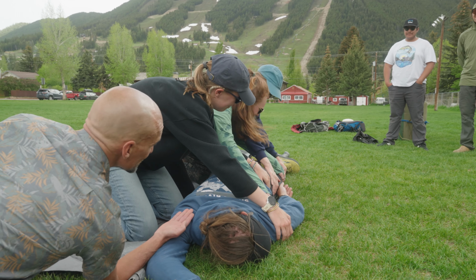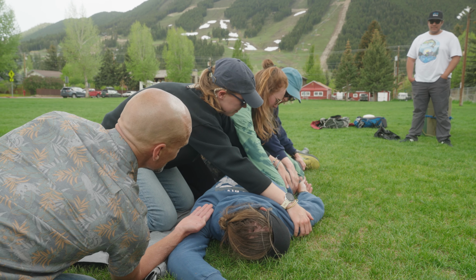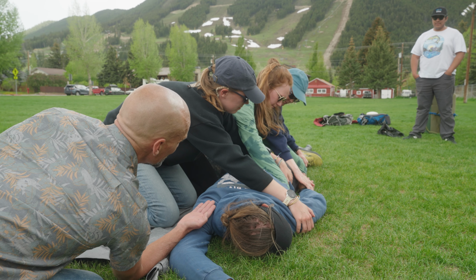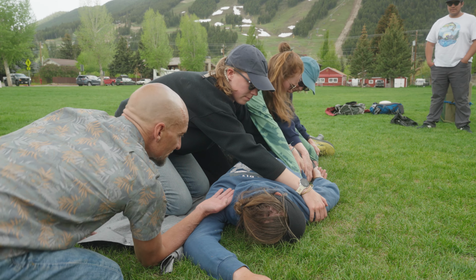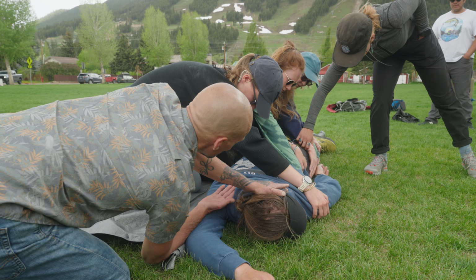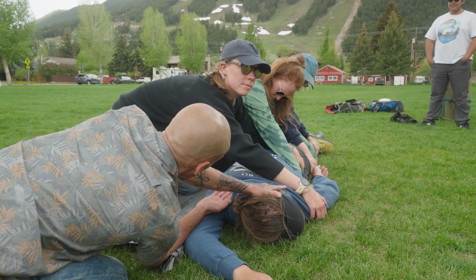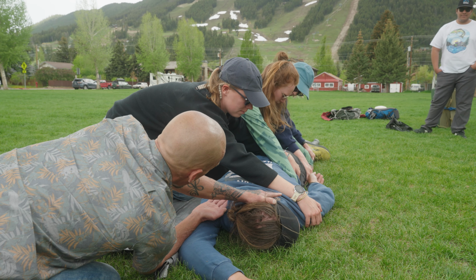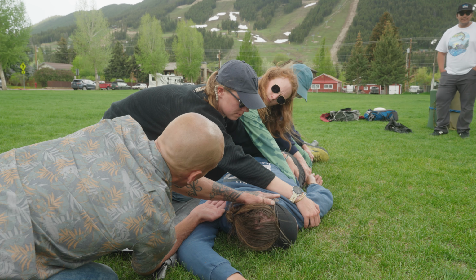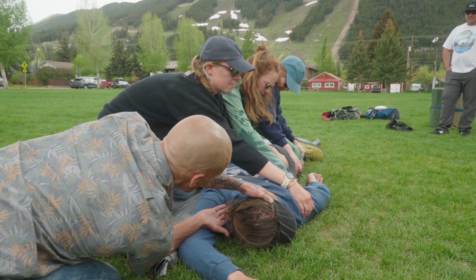Hands in position, so lead position, shoulder, hips, hips, knees, and then knee, ankle, crossing at the junction with your partner. On the count of 3, we're gonna slowly roll the patient towards you, onto their back into a supine position. Is anyone not ready? On 3. 1, 2, 3.